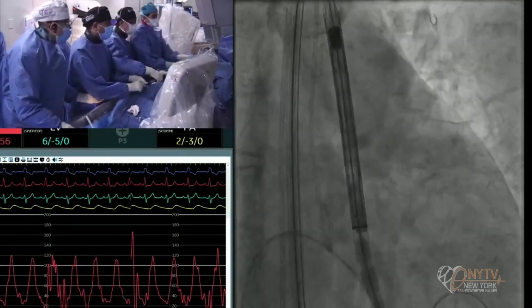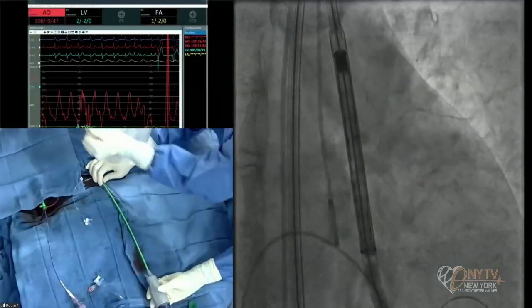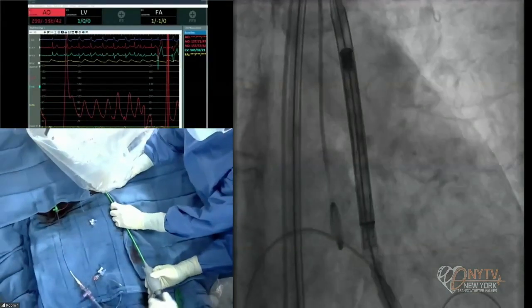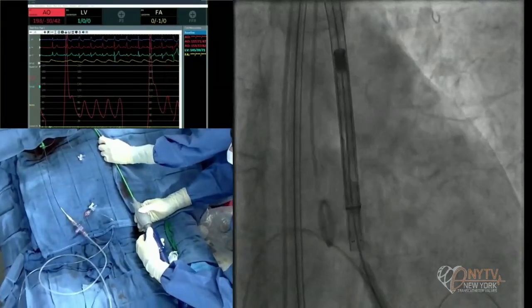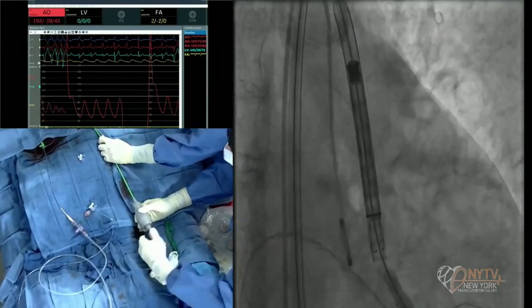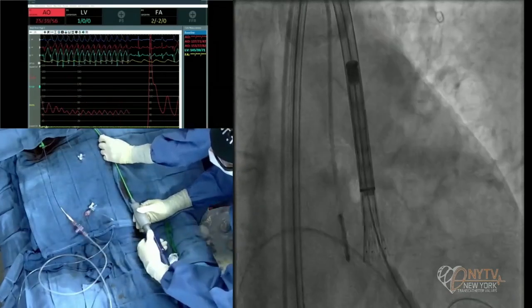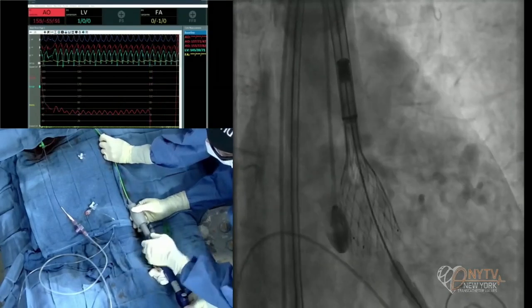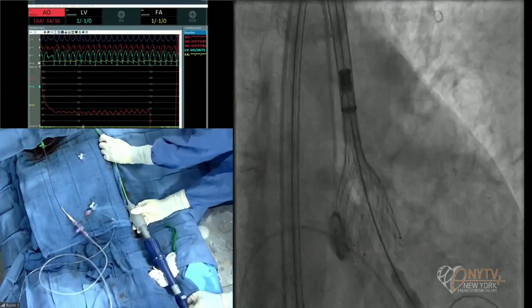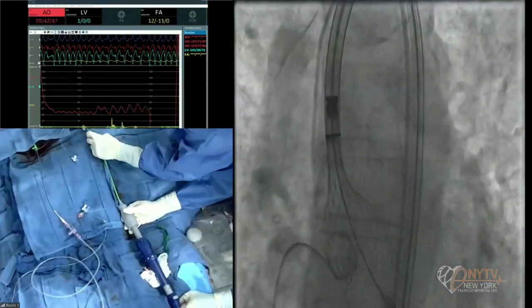All right, what is a pigtail? The pigtail very often gets entangled. You have to re-advance it a little. Good. A little high. 150. Inject. Good. Very good. Okay, inject. Push forward. Okay, 100, please. Push forward, push forward.